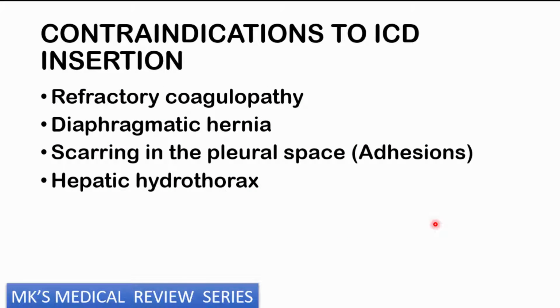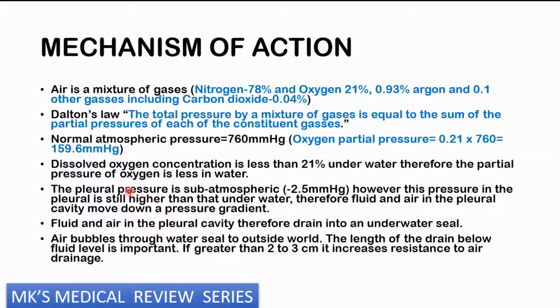Some contraindications to insertion of an ICD include conditions like refractory coagulopathies and bleeding disorders, diaphragmatic hernias. You may also have scarring in the pleural space, which of course are adhesions, as well as hepatic hydrothorax.